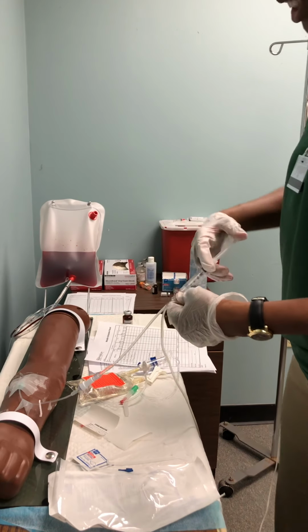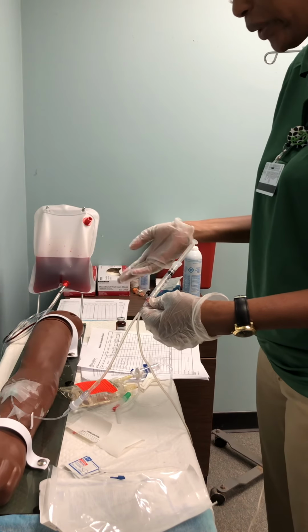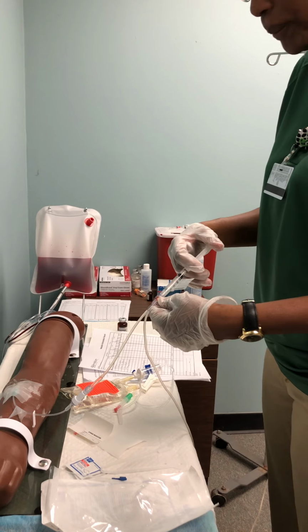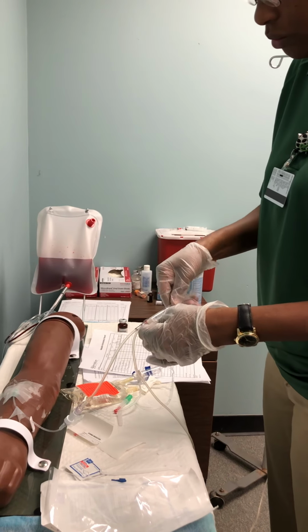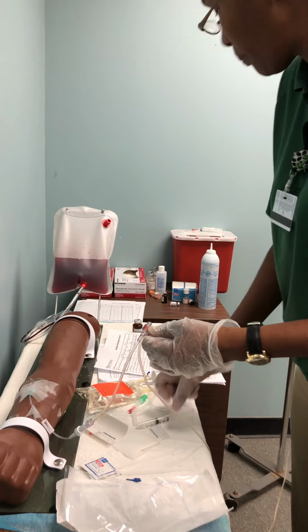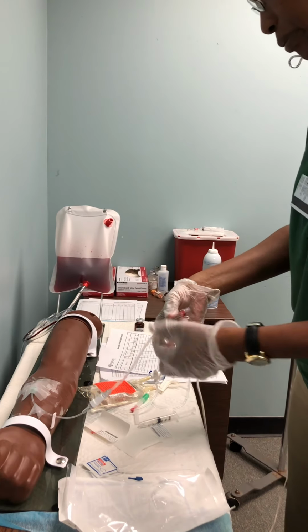And I'm going to push each 40 milligrams or fraction thereof over 1 to 2 minutes. I have 30 milligrams, so I'll push it over 1 to 2 minutes, using the push pause method. Okay, the Lasix is compatible with the D5W that's already hanging, so no need for me to flush.